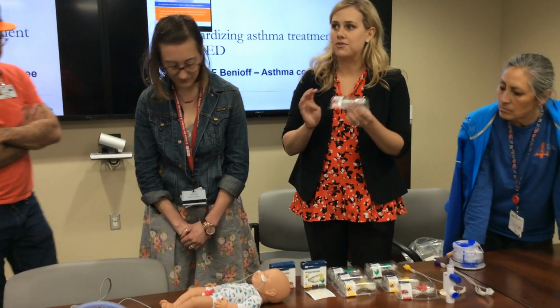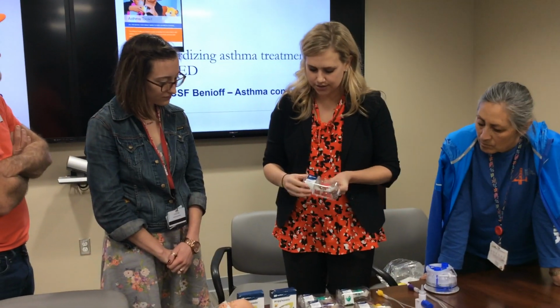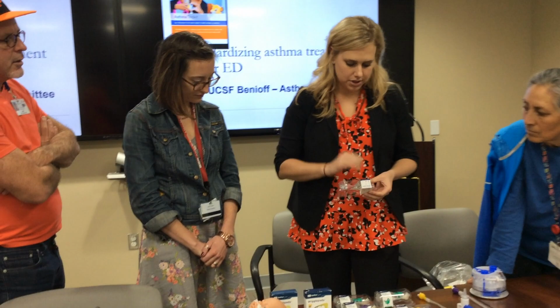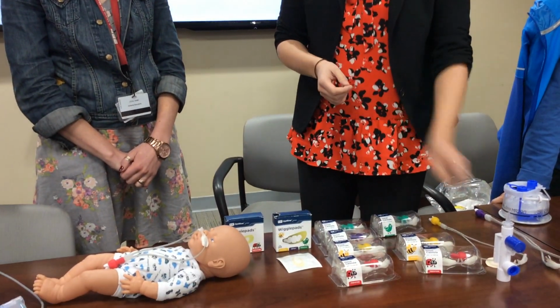So there are four sizes. Each size is color coded and has the size on it. On the back of the container, you have a little picture of the nares size, so you can use that as a guide. Like Katie said, you want 50% occlusion of the nares.